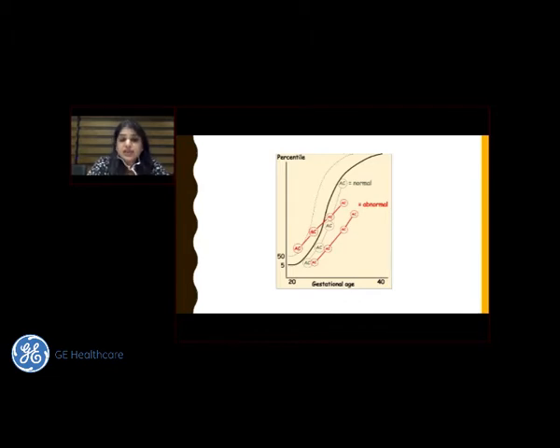But just keep in mind, a drop in centile is also to be noted and red flagged. I see her after 2 weeks. It is now crossing the 5th centile. Any waveform, any growth velocity that is crossing my expected line is not doing well.